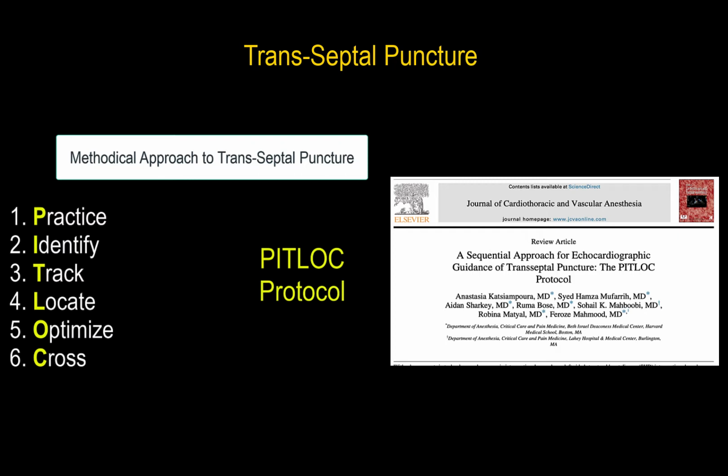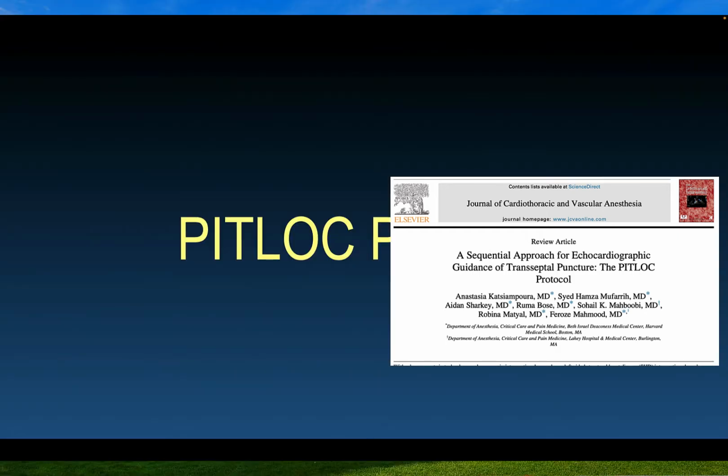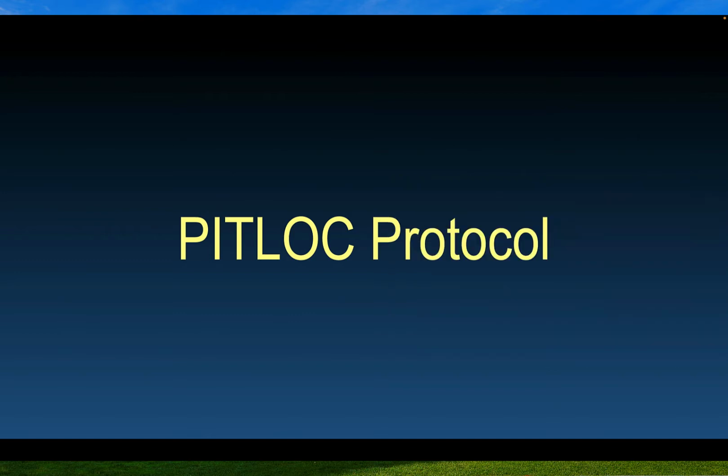So if you ask me in one line, the answer would be that we follow the Pitlock Protocol in doing this. And so, Feroz, just for those who haven't read the paper, can you run through the elements of the Pitlock Protocol? Yes, absolutely. This is based on deconstructing a complex procedure into its component parts.